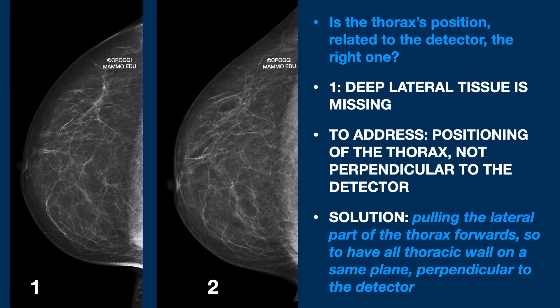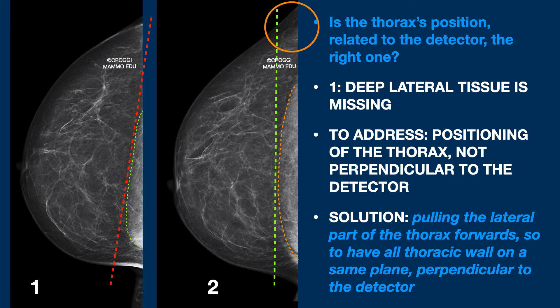Image one: posterior tissue is documented more medially than laterally, as you can see from the shape of the pectoralis major. So the thoracic wall is not on the perpendicular plane to the detector, as it is in the second image. The documentation of deep lateral tissue is proven by the presence of the lateral connection to the thorax, as you can see.